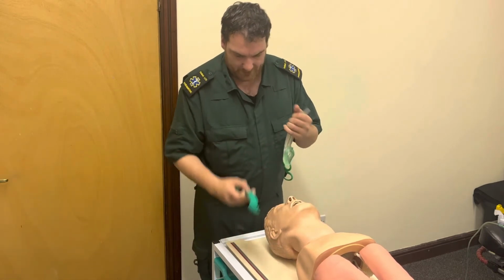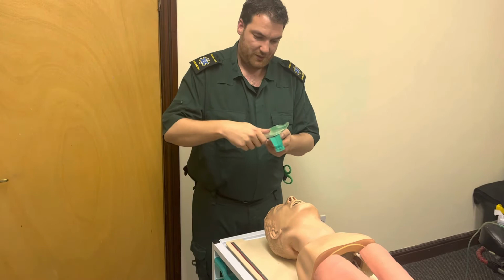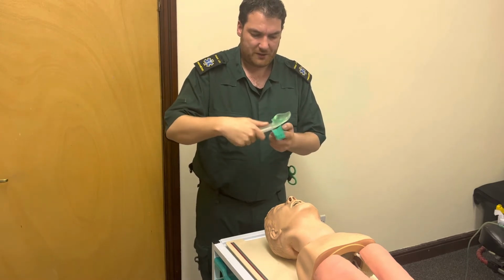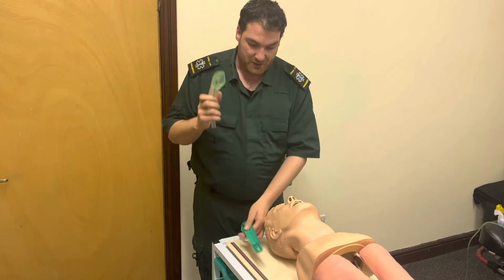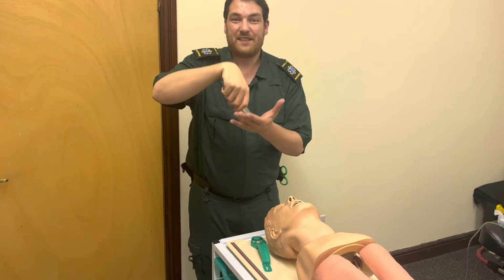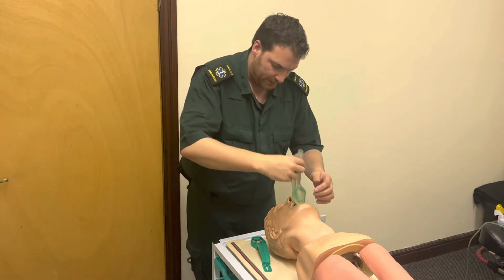But before I insert it, we want to make sure that we lubricate it, which I did beforehand, but I want to show you. So you lubricate the back and the sides. Never lubricate this part here. The gel-like substance goes into the airway and creates a seal around the laryngeal framework. So we're putting it in.